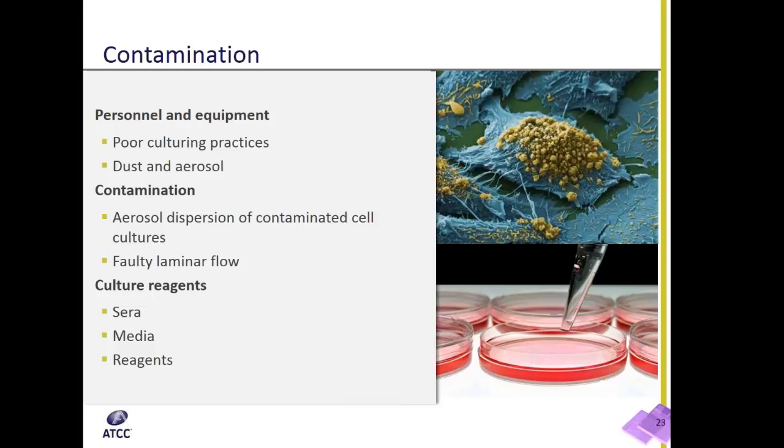Improperly maintained equipment can prevent protection from the entry of contaminants. Overpacking autoclaves or ovens can even cause problems when uneven heating creates pockets of non-sterile supplies in the oven. The flow rate of hoods, if not properly adjusted, can allow particulates to enter.